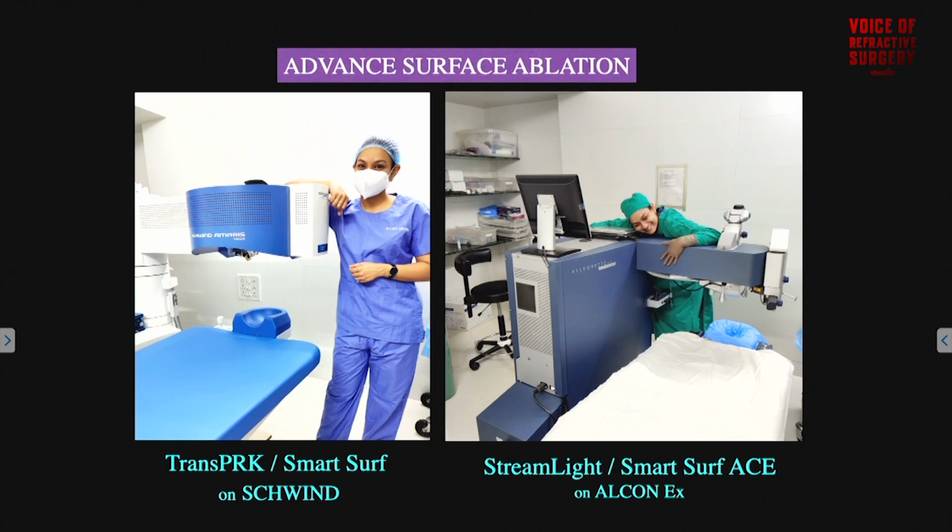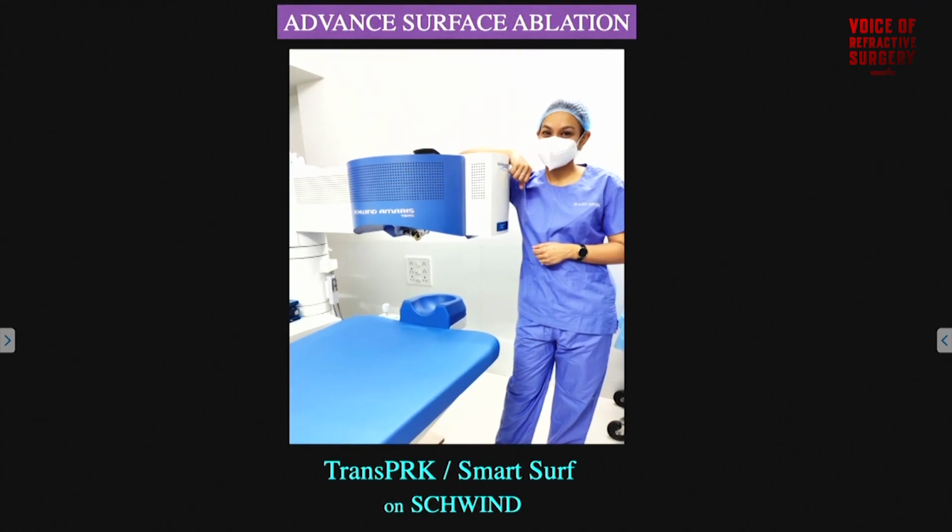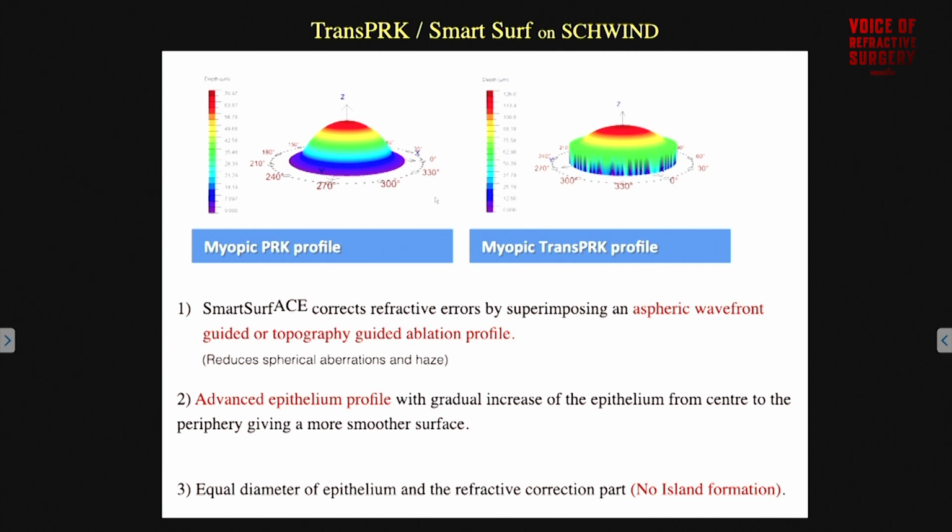Fortunately, I had the privilege of using both the platforms, that is the Streamlight as well as Trans PRK. So today I'm here to share my experience on the Schwind platform. And how Schwind is different from the other technologies is that, like we were just discussing, it creates an aspheric wavefront guided ablation profile, which definitely has a better ablation profile and hence lesser haze. And like sir was just mentioning, it has an advanced epithelial profiling.